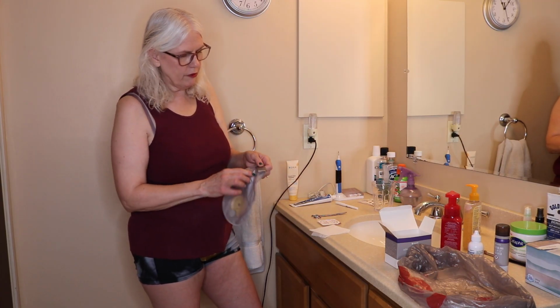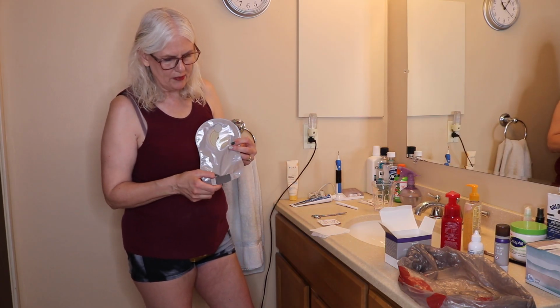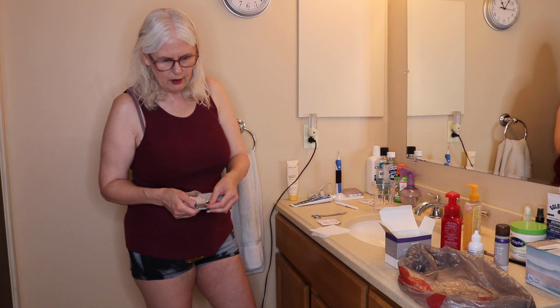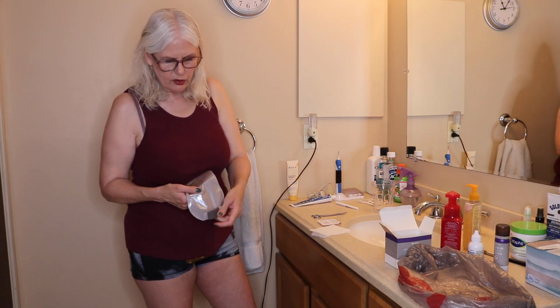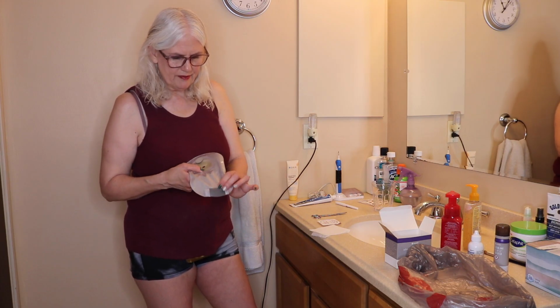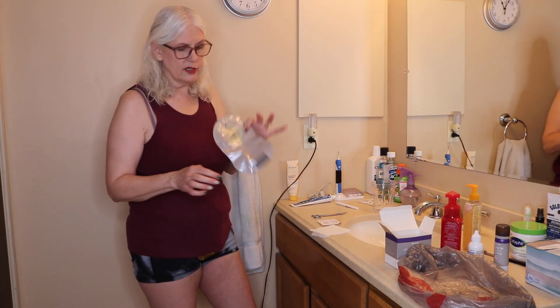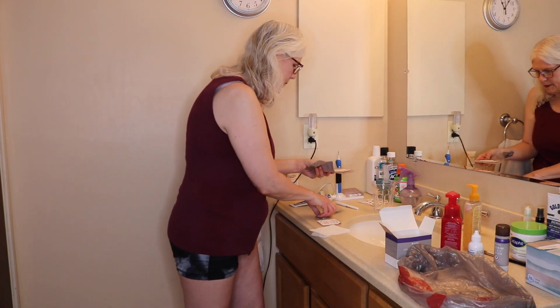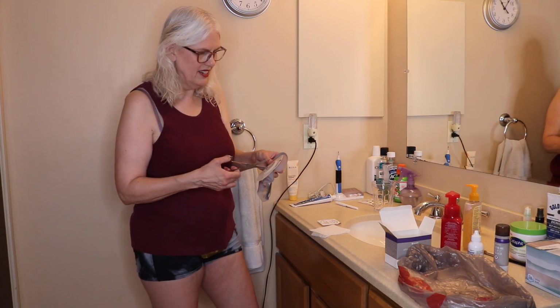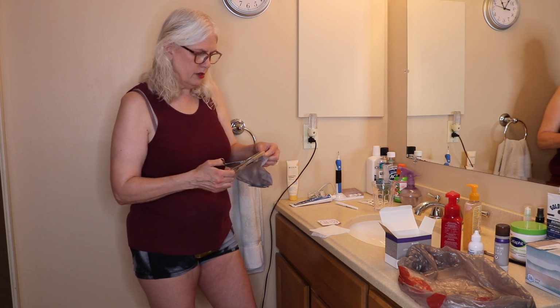I forgot, as I'm closing this up, I'm looking for the area I tuck it, and that's the thing. One thing I did not like about this bag is that there is no protective area on here. Now granted, the Velcro area goes down. So again, your clothes rubbing on here or anything, it shouldn't catch this and open it, as opposed to if this were going up. But I forgot about that. It's been a while. When I first ordered these, they were out of the complete gray ones, so they sent me this to try. And I'm like, well, it's okay, but it's not protected. Didn't care for that. But it was fine. I didn't have any problems with it.